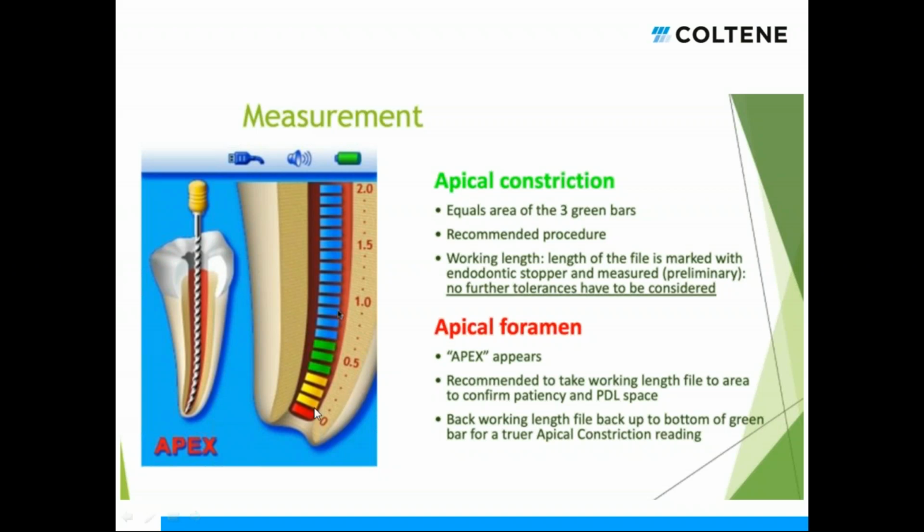Yeah. But I feel like if every time you're taking a file to red, you're one of those 90% out of the actual apical foramen. Yeah, and those 90% could have been everybody I've talked to already, because that to me was where we needed to be, but it's really not. So I just love the better understanding that we got. That's my tidbit. Thanks, guys.